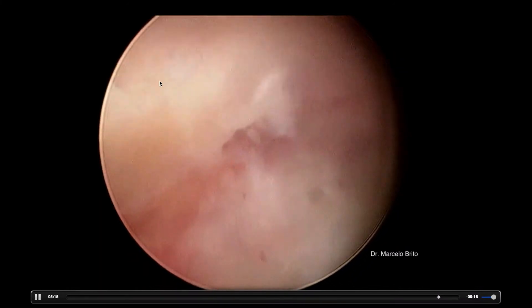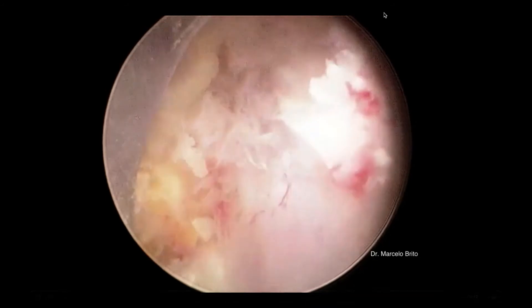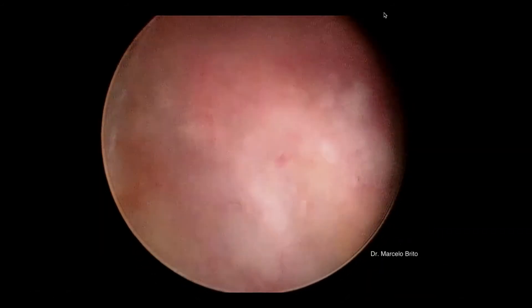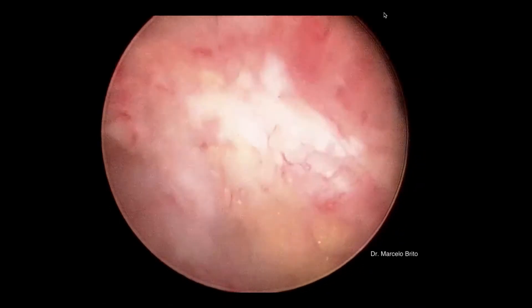We're seeing the facet joint and the foramen. And now we're turning to the dural sac to see that even when we are on the other side — the contralateral side — the dural sac is still decompressed, and our cannula is not actually causing any compression.